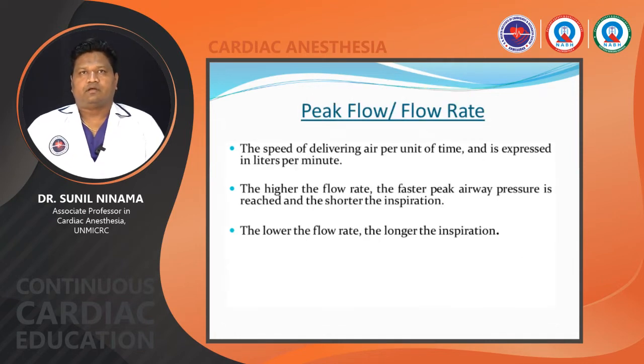Peak flow rate and flow rate. The speed of delivering the air per unit of time, expressed in liters per minute, is called peak flow rate. The higher the flow rate, the faster the peak airway pressure is reached and the shorter the inspiration, and the lower the flow rate, the longer the inspiration.